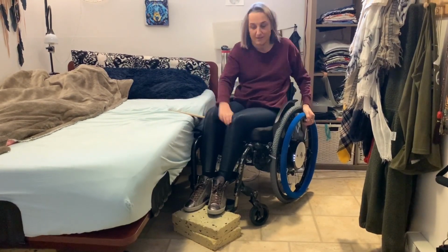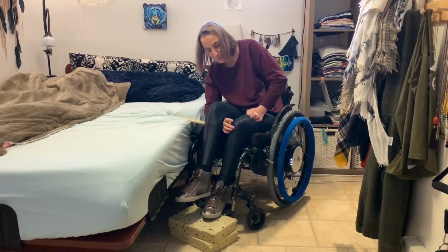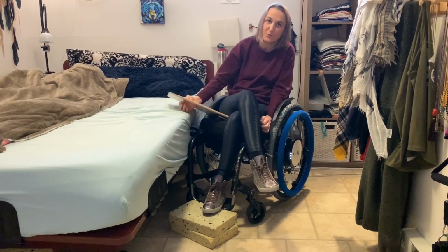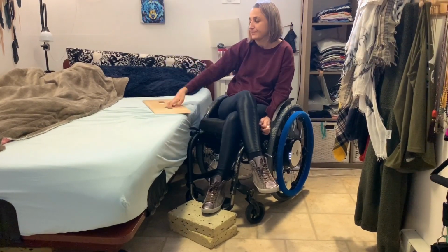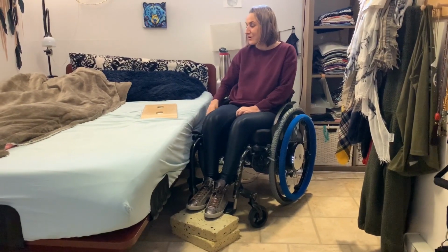And again, taking the board from underneath when you're on the chair, and only cross my leg, and then wedge it off. Especially when it's got the grippy part and stuff underneath. And there you go. This is how I transfer with a board.